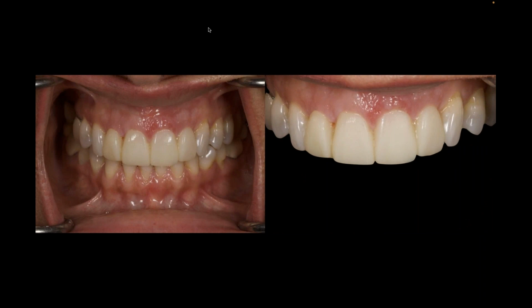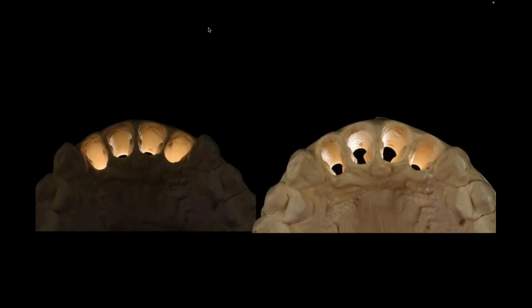She's only doing 4 veneers, and it was mostly for color and closing some of the black triangles. After we worked our way through the functional aspects of the patient and got her happy and set, these were actually done as refractory veneers. So I still do a lot of refractory veneers, especially when I have more space to work in, maybe 6, 7, 8/10 of a millimeter.